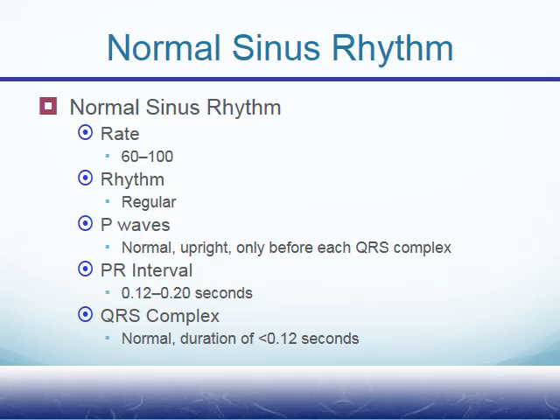So first we're going to talk about regular sinus rhythm, and we're really just going to have to go through and look at the rules for each rhythm that we have, and then look at the differing rules and how we're going to establish what the heart rhythm is.